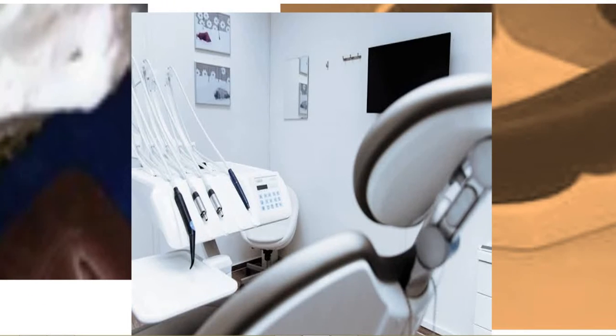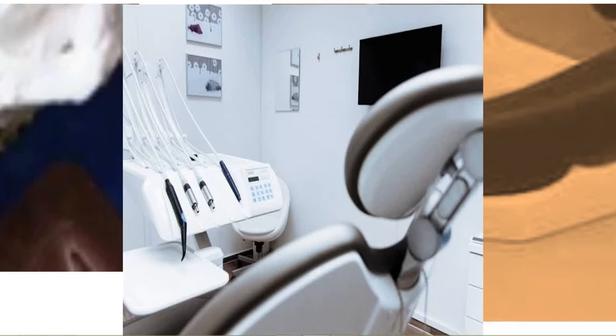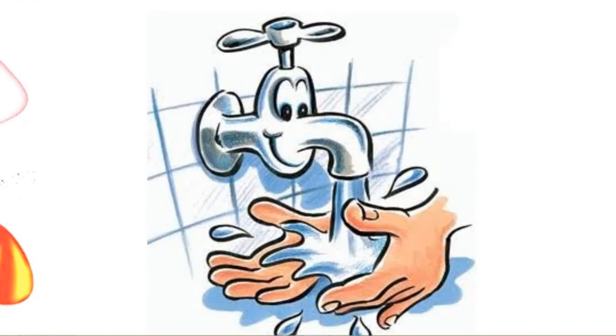Optimally, impression should be decontaminated thoroughly with the chairside disinfection method immediately after removal from the patient's mouth, and PPE must be utilized. Impression should be thoroughly rinsed under running water for the removal of the saliva and the blood, which can act as a bioburden, as much as possible. And two methods of disinfection have been recommended, that is spraying and immersion.